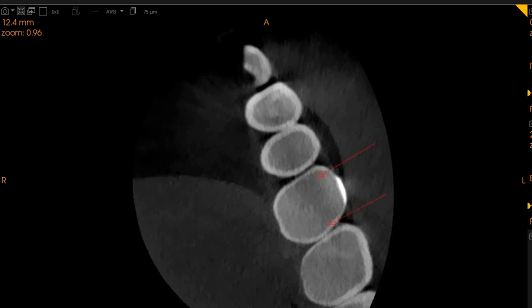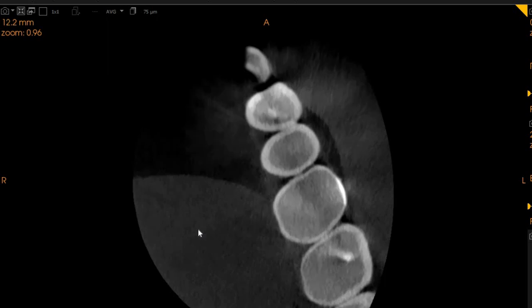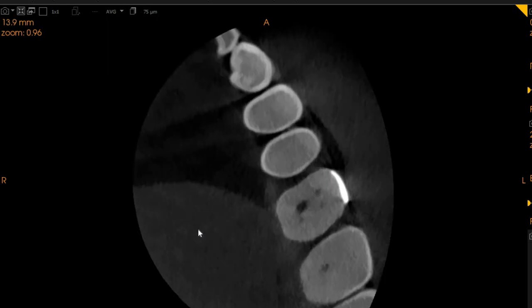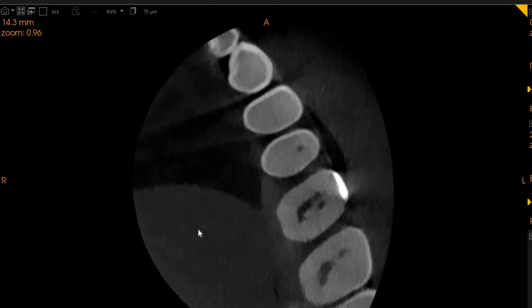The area of interest is the upper left first molar for crack evaluation. When we look at the crown structure, we can see a crack extending from the mesial all the way to the distal aspect. Moving further down towards the chamber, this is the same area where we continue to evaluate the crack.